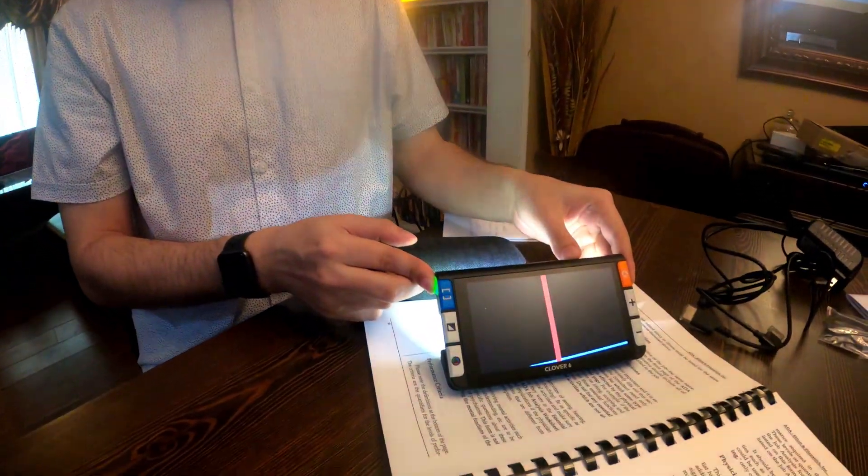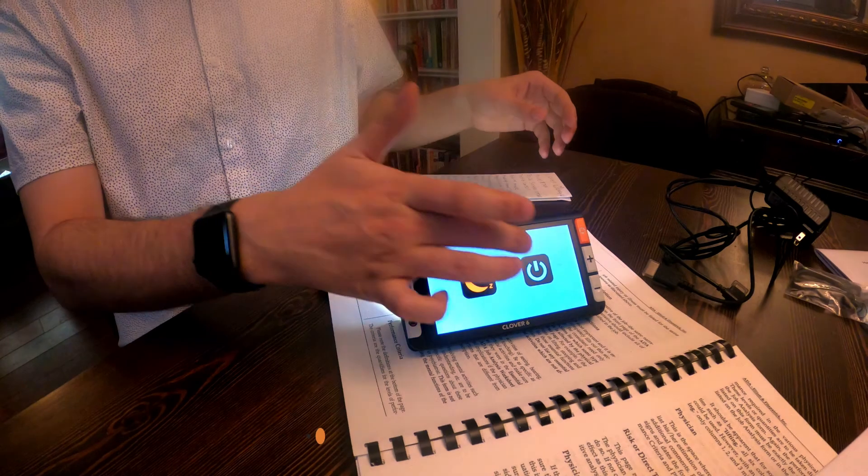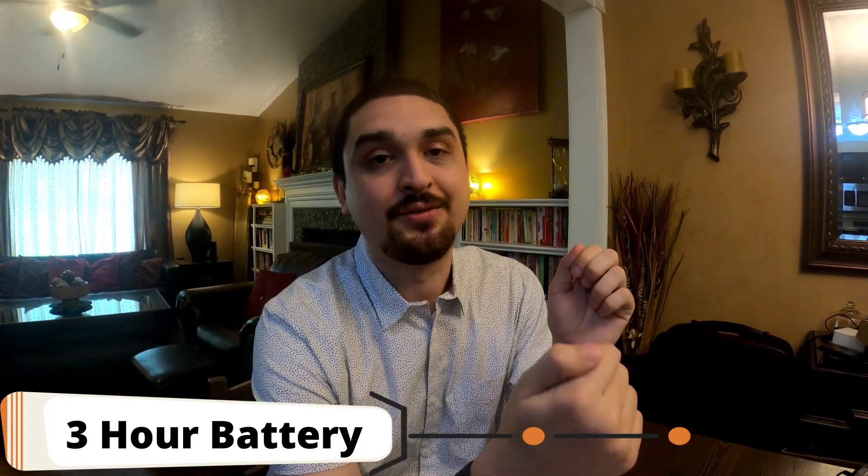This is $795 and it has touchscreen and tactile controls, a photo mode, and a panning mode while in photo mode. Supposedly it has three hours of continuous use battery life. You can extend that if you turn the device off when not in use, but three hours is a long time for a video magnifier.